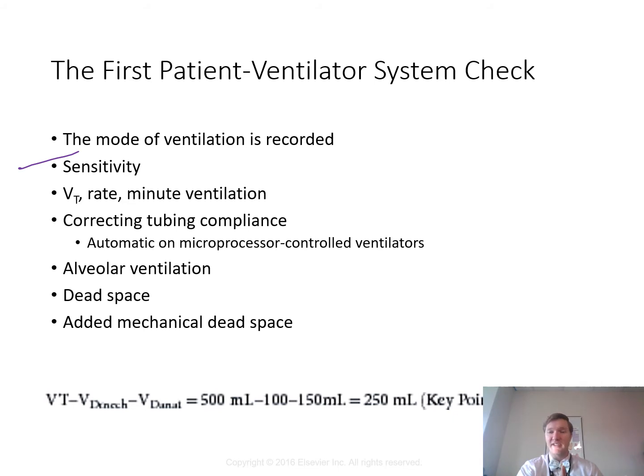How are we going to fix this? Well, this means I'm going to increase my flow rate to help reduce my inspiratory time, right? And then therefore I could reduce the rate. In theory, I could also reduce the tidal volume as well. So all those things will help create a longer expiratory time, which should help as well. Changing modes as well might help with more spontaneous breaths if they're air stacking, right? If they're auto peeping quite a bit.